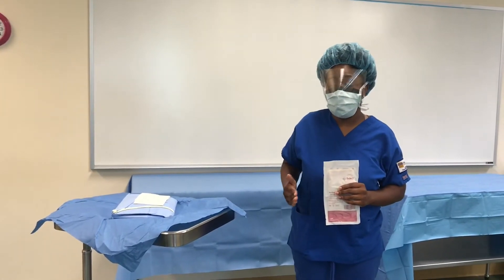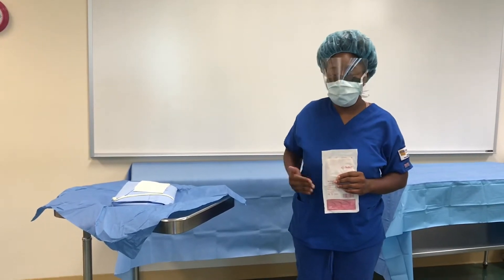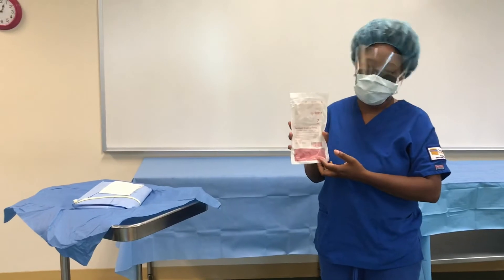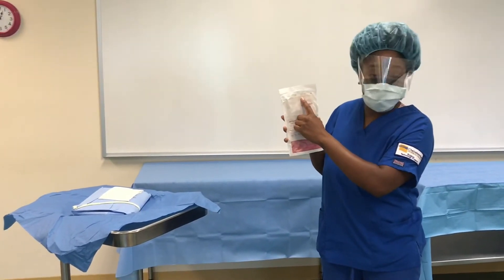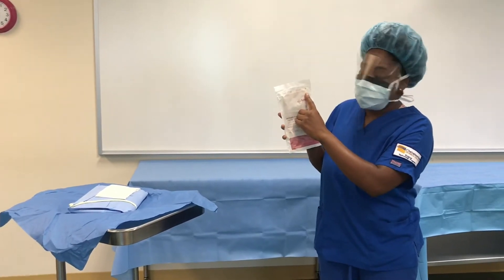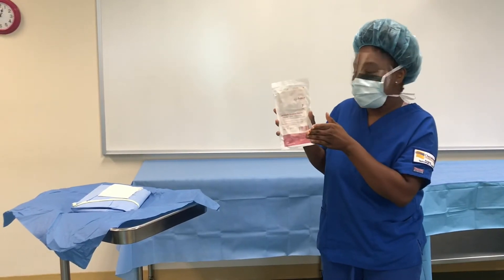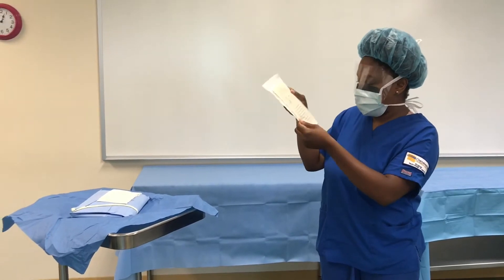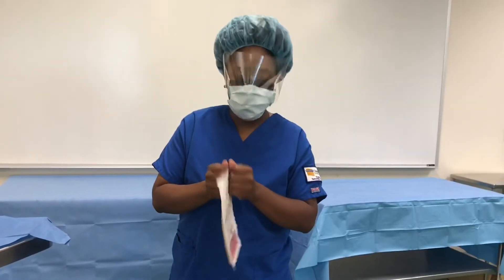While you're doing this, you want to make sure you are a foot away — 12 inches — from any sterile area before you open up your gloves. You want to check the sterilization date, the day it was sterilized, and you want to check the expiration date. If it is past the time, you cannot use these. Also check the integrity: look around and make sure there are no holes or slits within the package.